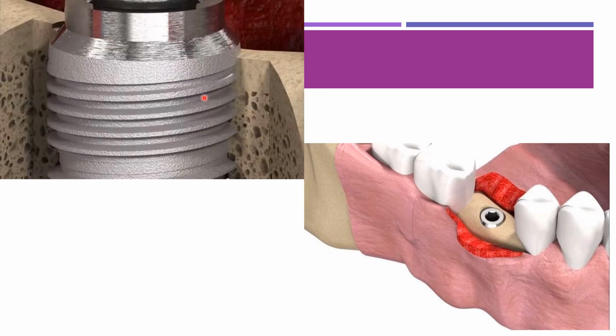The next area, you can see that the thread should be completely inserted into the bone. It should not be exposed. So the upper implant shoulder should be seated at the bone surface if it is a submerged implant. Otherwise, for non-submerged implants, the implant shoulder will be at a slightly higher level. You can see that this is the submerged type of implant, at the bony margin. This implant has been placed.